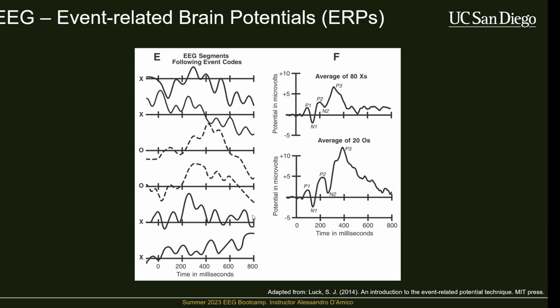Again, not impossible, but that is still a relatively young field. And the other thing, which I don't think I have slides on because I didn't think I would talk about it, but it's good to talk about, is that EEG signals are non-stationary.